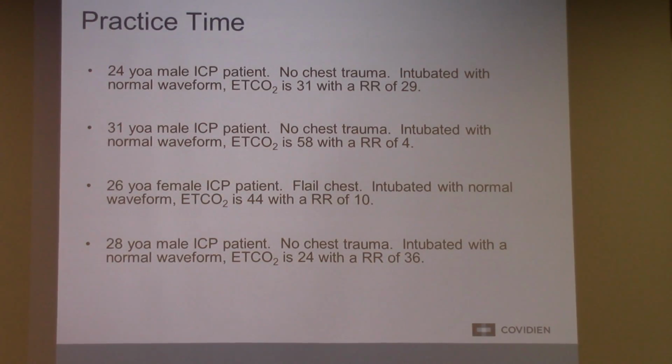What are they doing to themselves? Yeah, smack them. They're making it way worse than the bleed. This, in my opinion, is the best argument for RSI, not chemical assistance like Versed and ketamine, RSI in a basic pre-hospital, normal, everyday transport crew. Because what this patient really needs is to be paralyzed and you take over their breathing for them. Get that CO2 up so we're not over-constricting.